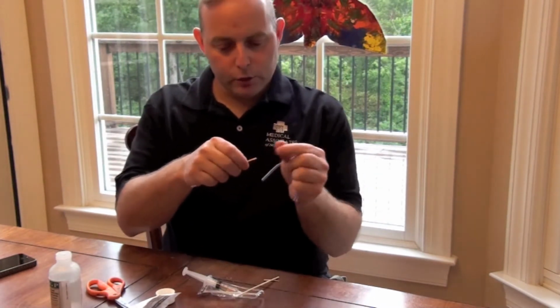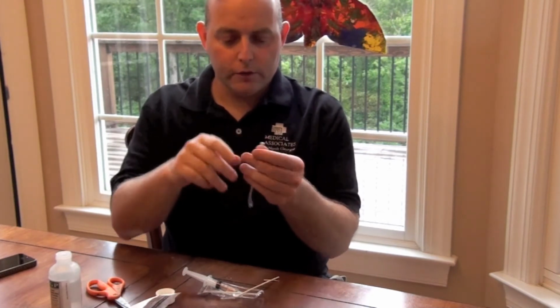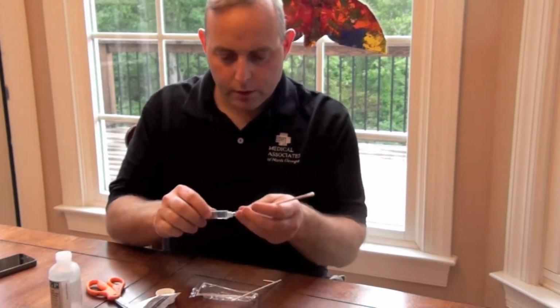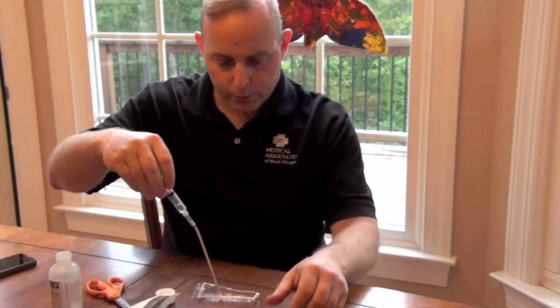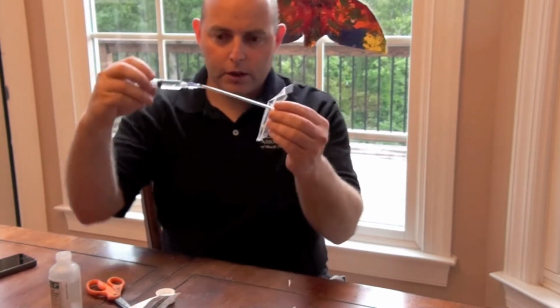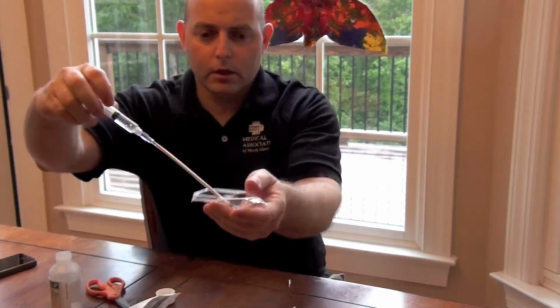Then take off any little loose pieces, because we don't want to accidentally inject that into the nasopharynx. From here, we will prime it. Fix it onto the syringe and just hold, or if it's for someone else's nose, don't hold the end. And you'll see that the injectate will come right out the end.